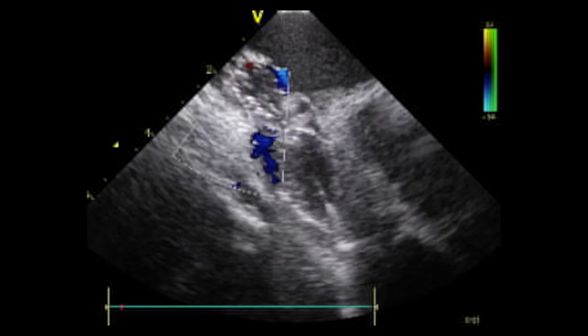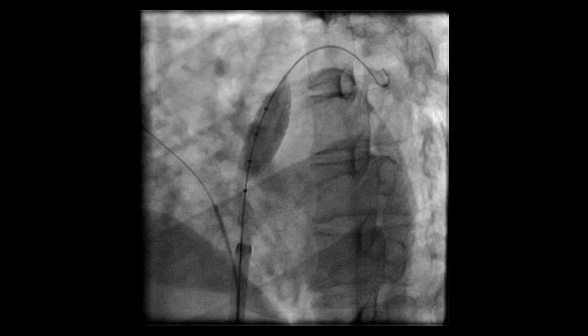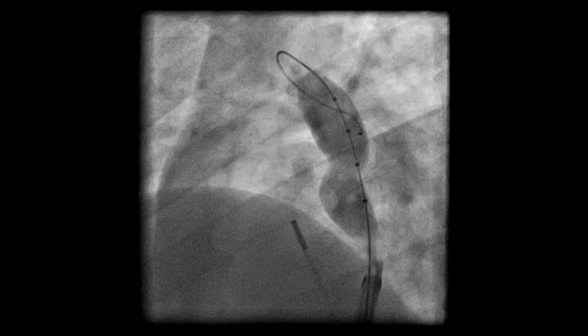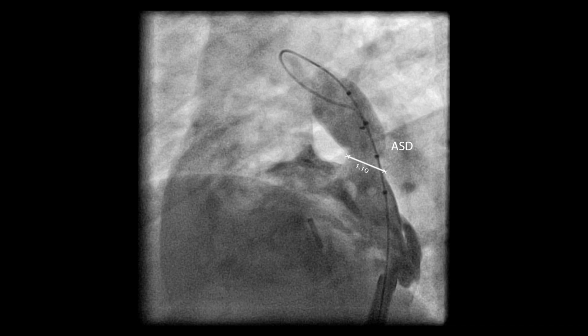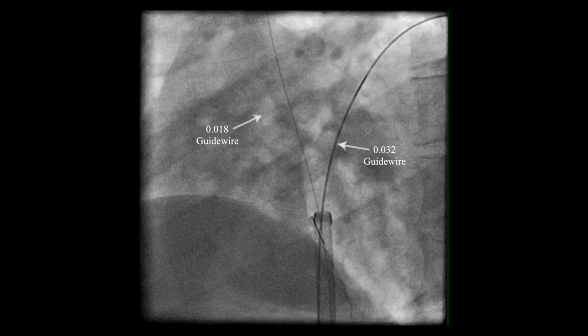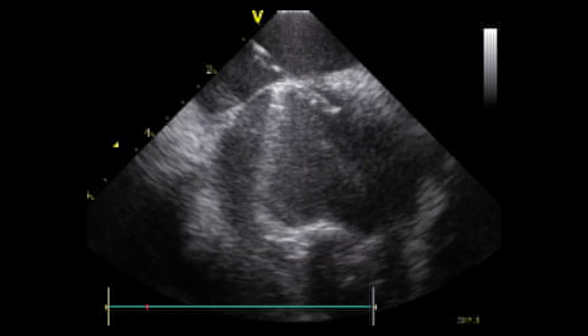First, we identified the atrial septal defect. Here you can see a balloon through the atrial septal defect, and an attempt to put a wire through the patent foramen ovale, which was not possible at this time as a result of the atrial septal aneurysm. The atrial septal defect was greater than 1 cm in diameter. An 018 wire was placed in the superior vena cava, and an 032 wire through the atrial septal defect.